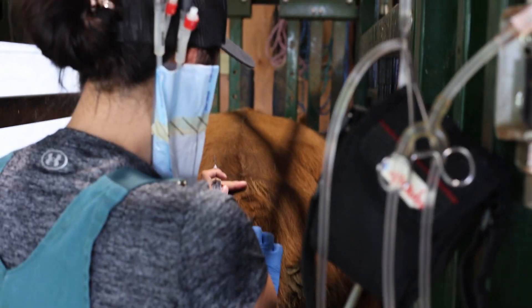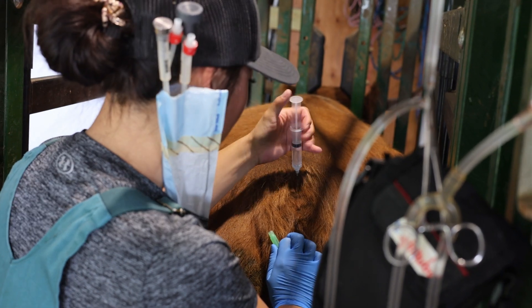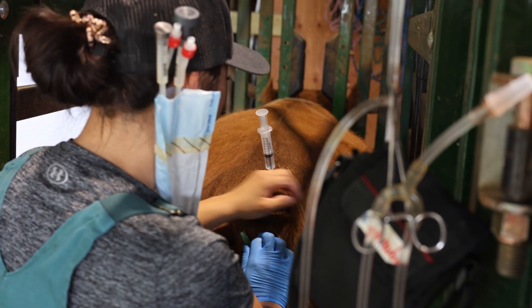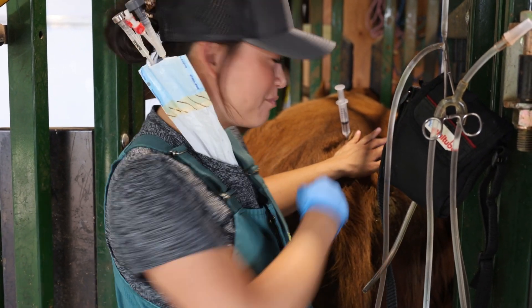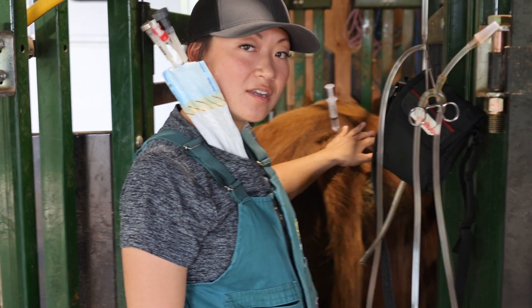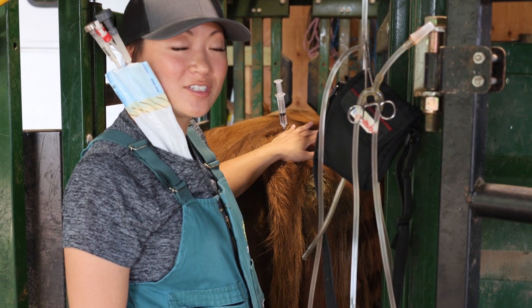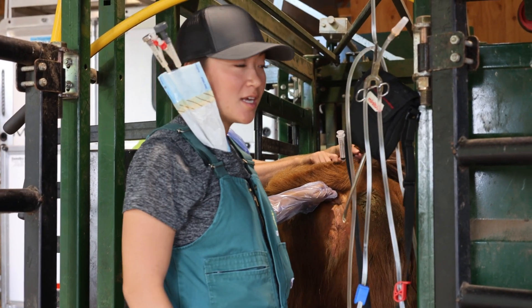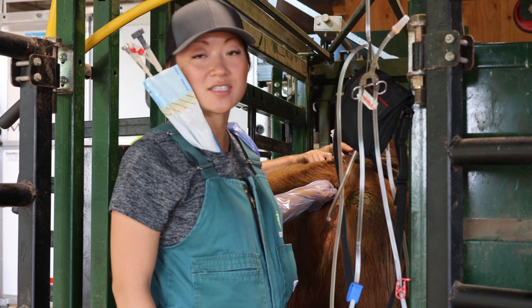Ashley, this is the epidural you're about to administer? Yes. An epidural goes in the spine, which has a nerve running through the center of it. When we give the epidural we're targeting that nerve space. It works a lot like Novocaine at the dentist's office — it surrounds that nerve and makes everything from where the nerve starts and back go a little bit numb. It lasts about an hour depending on the dose, and it takes effect within a few seconds to a couple of minutes. We've got Juul all cleaned up here. One of the biggest things about embryo transfer is cleanliness, because if the environment can sustain and grow an embryo, it can sustain and grow bacteria, which is detrimental to pregnancy rates and the viability of embryos.